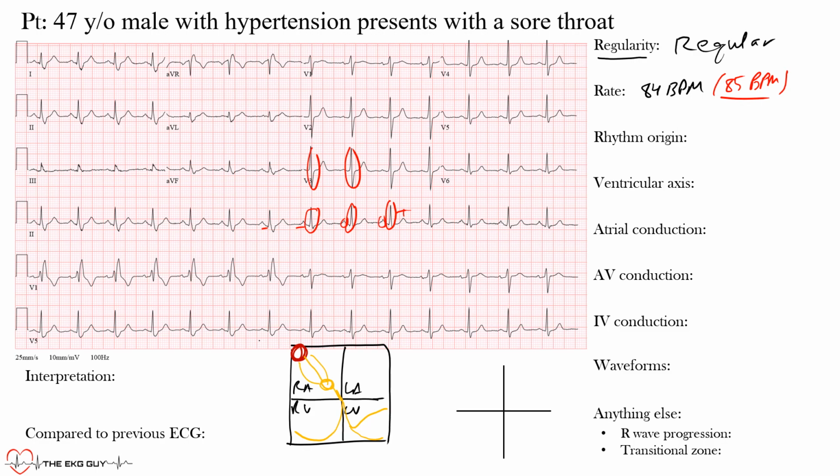So our sinus node is up here, right? We said conduction will be heading in this direction. So now let's take this right atrium right here that we have, okay, and let's put it right here. So put our right atrium there. Here's our sinus node. Conduction's heading in this direction. So now we have to know the lead sitting there. Here's lead 1, lead AVF, okay. Lead 2 sits here at positive 60 degrees. AVR's here. In the horizontal plane, we have V4, V5, and V6.